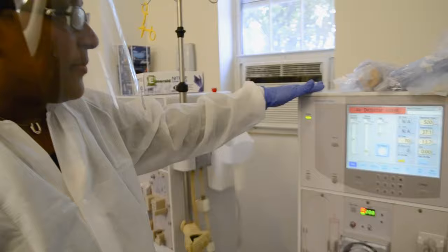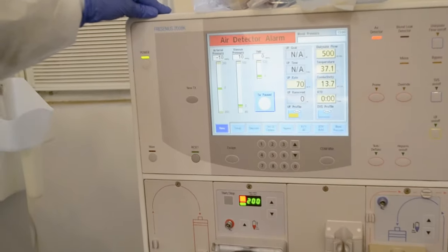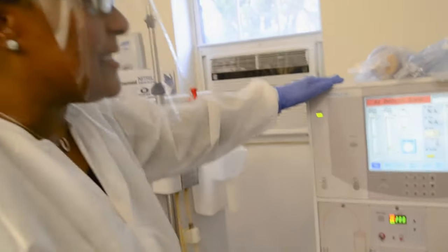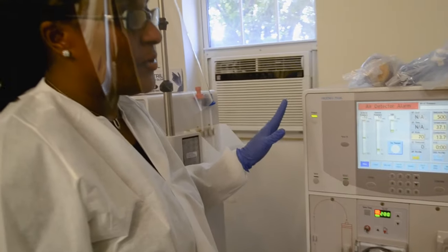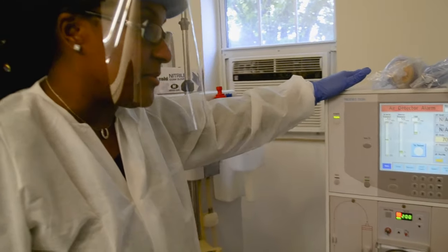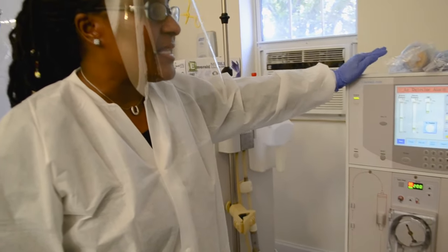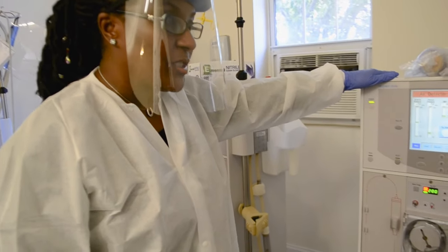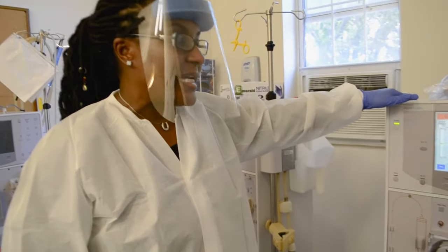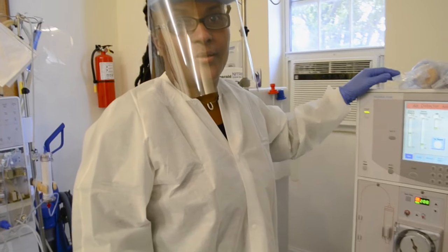Today we're going to set up the Fresenius K machine, K as in kilo. There is a newer machine to this one. However, I guarantee you that once you have learned how to proficiently set up this machine, which is the K, you will have absolutely no problems setting up the T machine. Because these are the machines we're using at the school site, where we're filming this video, you will be able to master that skill very quickly using this video to supplement your skills training.